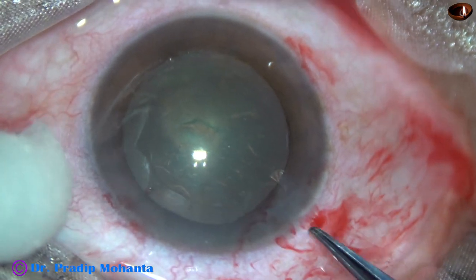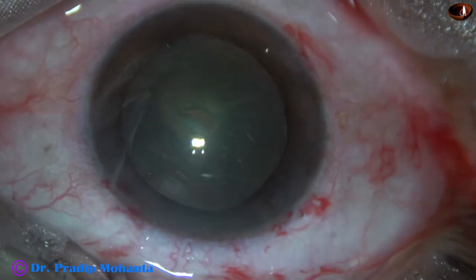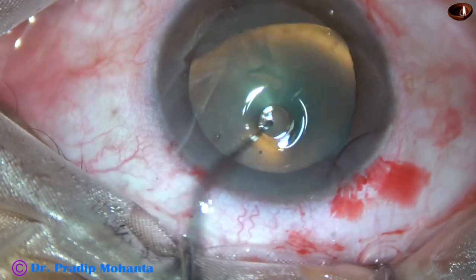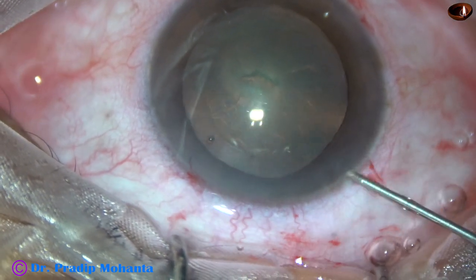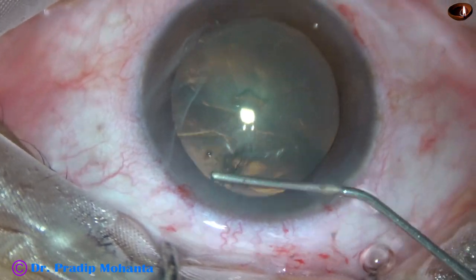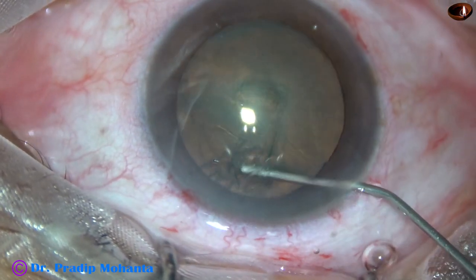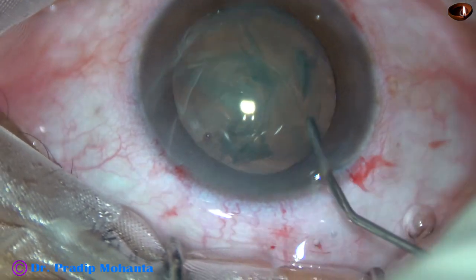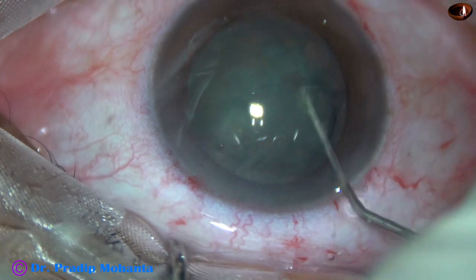And now, hydrodissection. A 27-gauge cannula and BSS is used to do hydrodissection. The fluid wave goes to the opposite side. The nucleus is tapped and the nucleus is rotated.